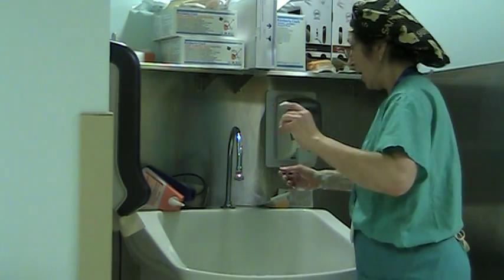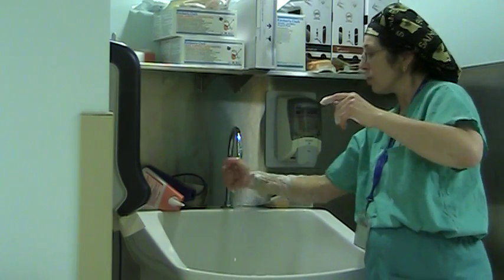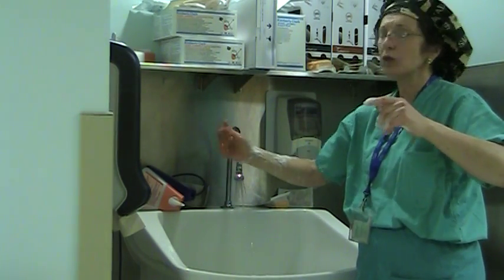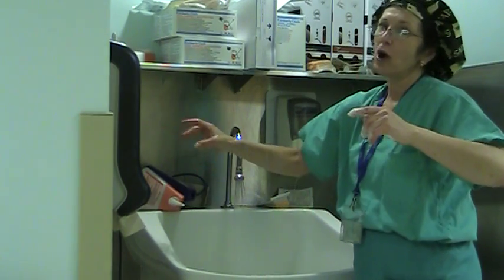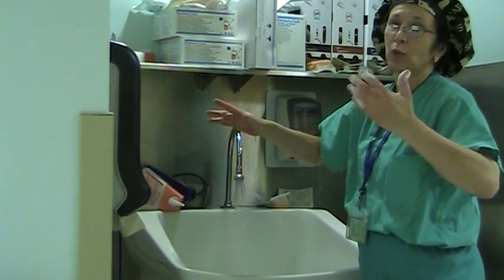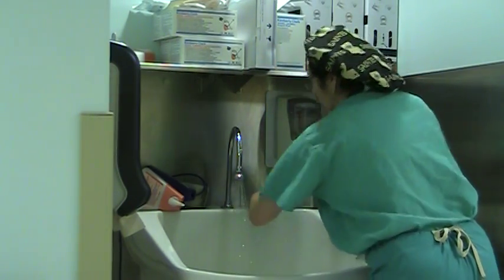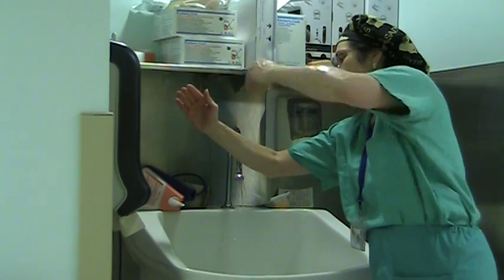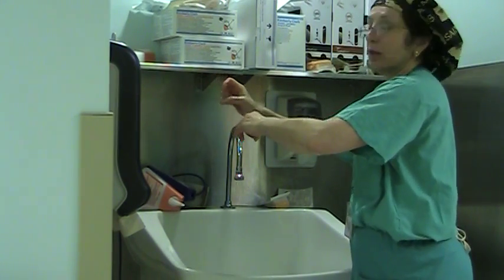Once I've completed one arm, I do the next one. When I'm finished, I throw the brush in the appropriate receptacle — usually red. Then I kind of squeeze my fingers to shake off as much soap as possible, because it's very hard to get your gloves on if you've got soap all over your hands. I go in an upward motion to get the water flowing down. Now we're ready to gown and glove.